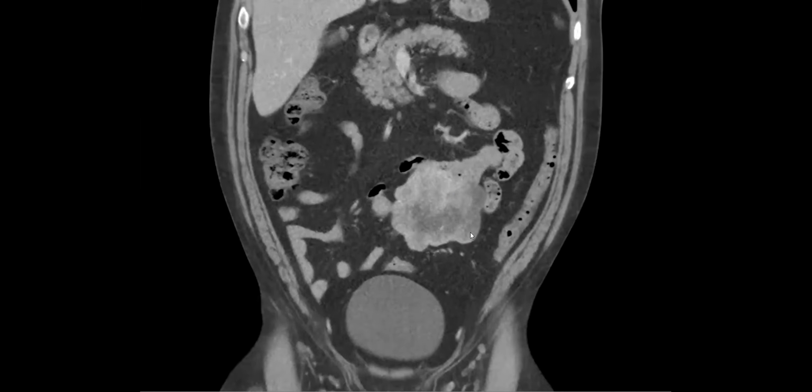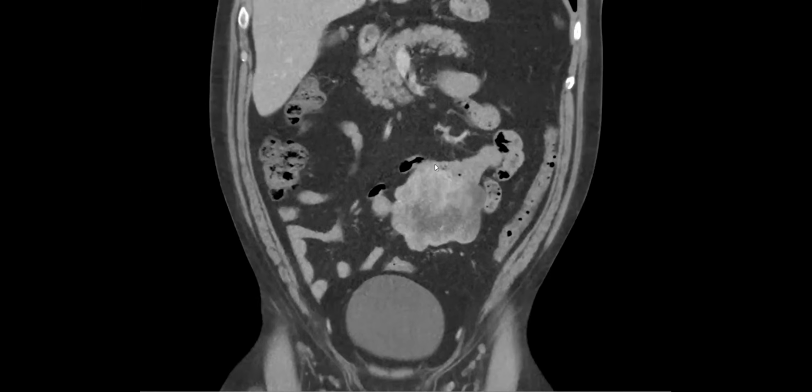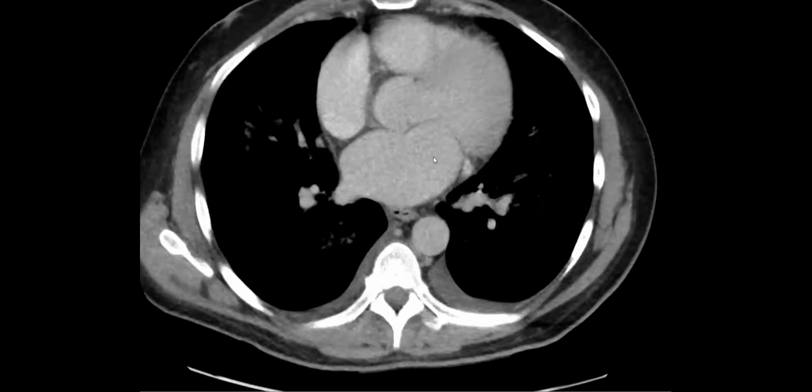So this was a GIST. Small bowel GIST is worse than gastric. So we put it into the nomogram, and it was interesting. It was 10 centimeters arising from the small bowel, and then you also put in the mitotic index. If the mitotic index is low, they had about a 50% chance of recurrence at 5 years. If the mitotic index was high, they had a 99% chance of recurrence within 5 years. We now have the 5-year follow-up, and I will show it to you.